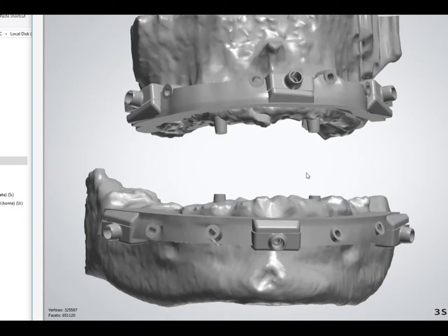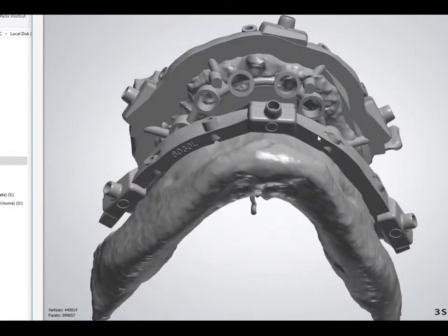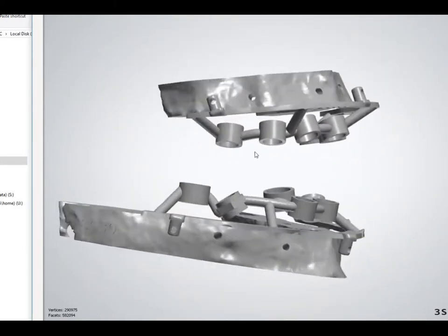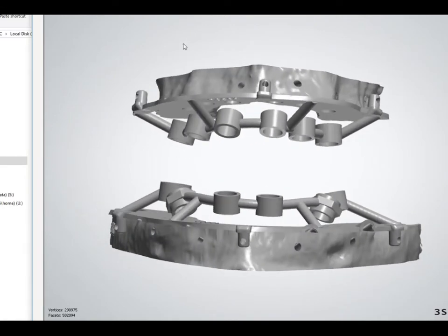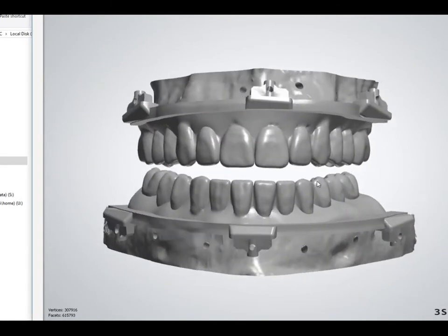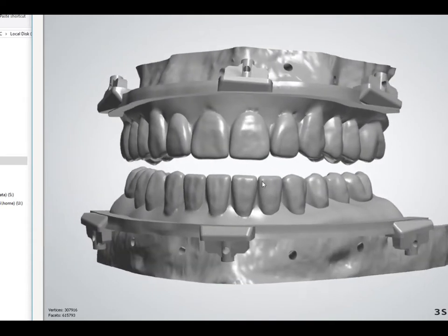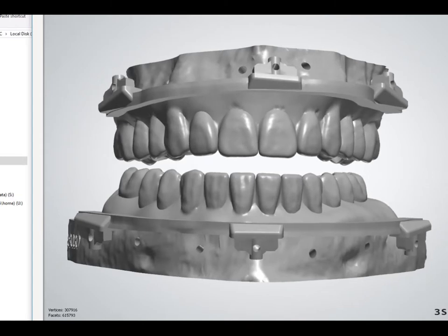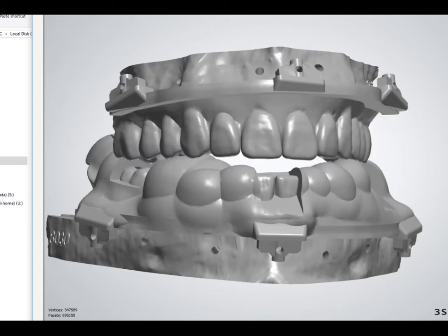On top of that is the pin guide for supporting the prosthetic. On top of that is the osteotomy guides. Here you can see the bone reduction with the osteotomy guide in place. And then finally the new prosthetic teeth. Again, all designed from the SMILE simulation even before we got started on the case. Patient and doctor approved the SMILE simulation. And then finally the pin guides for delivery of the fixation base.